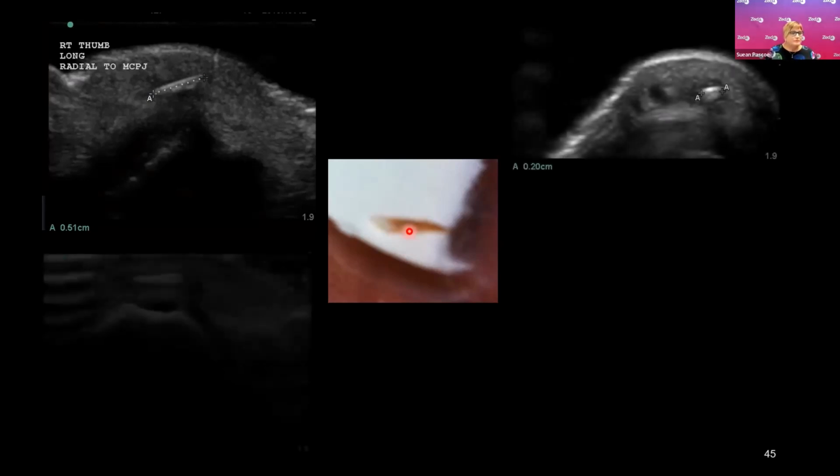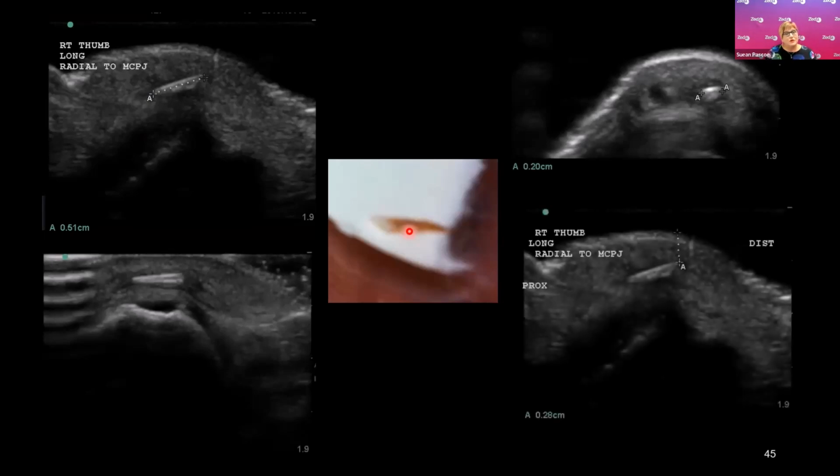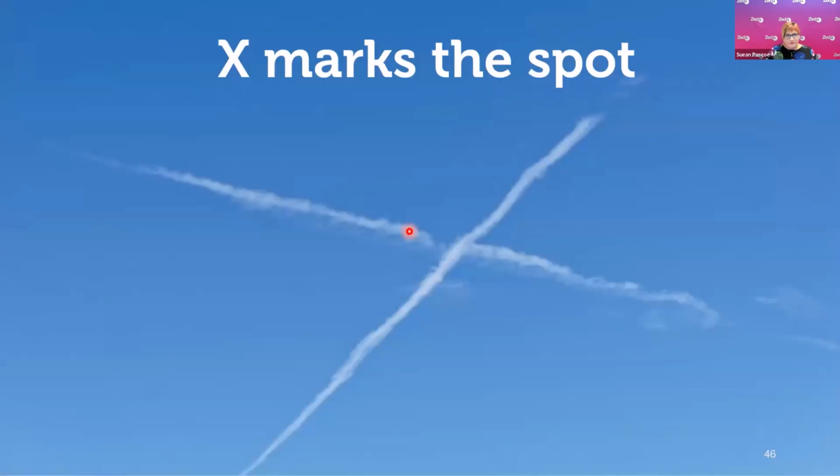So we measured the length of the prawn claw, the width of it, the depth from the skin surface to the edge of it. And so then she could go to the GP and have that cut down. We could report that it was 3 millimeters underneath the skin surface, and you're looking for an object that's at least this big.